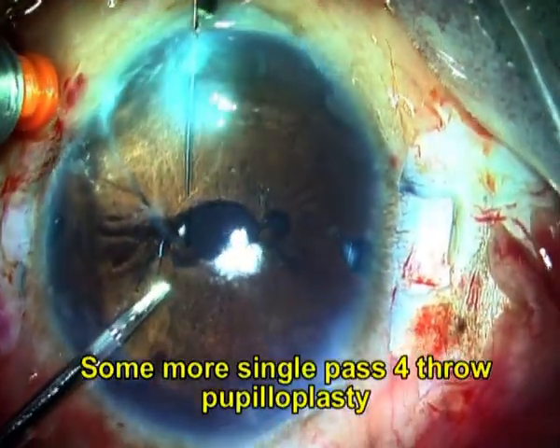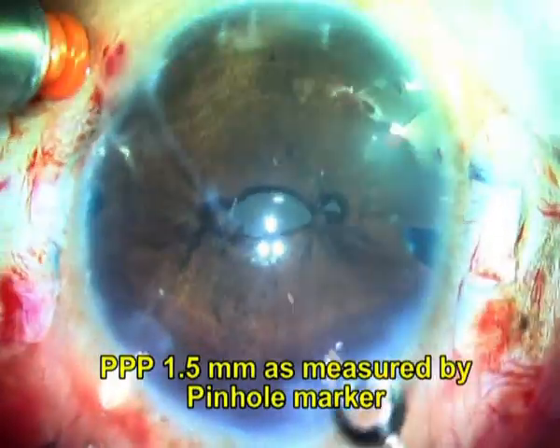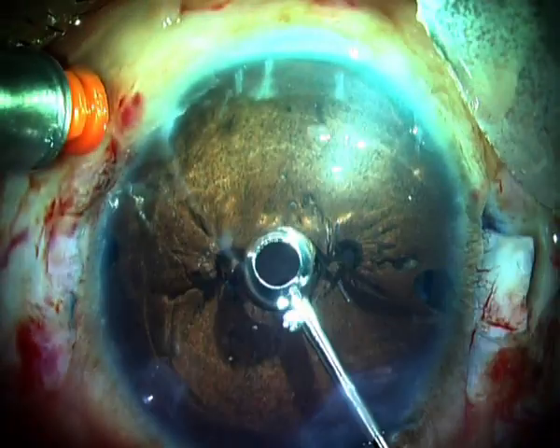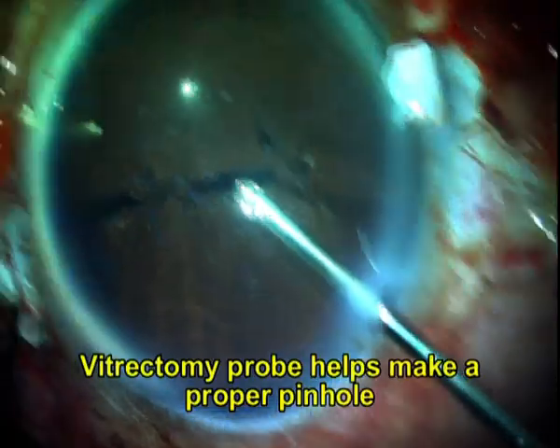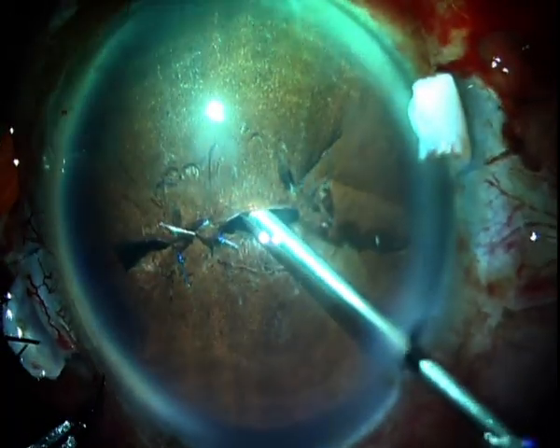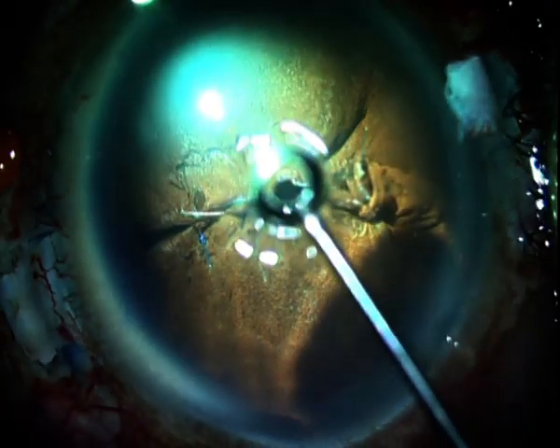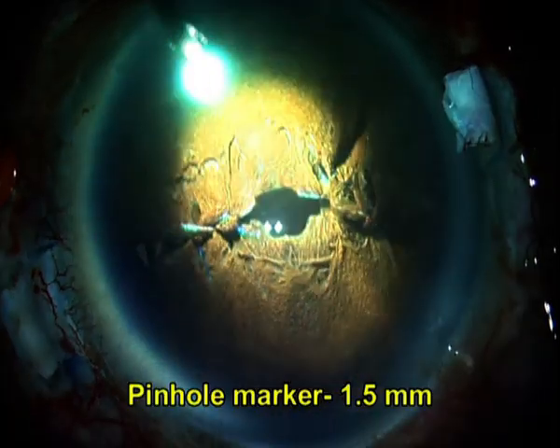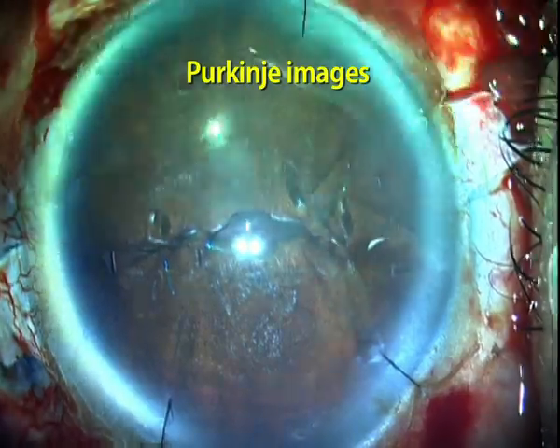Pinhole pupilloplasty, or PPP, helps to filter the stray light from the periphery of the cornea in cases with higher order corneal irregular astigmatism. The pinhole marker can be used at the corneal level, as seen in this case of keratoglobus, where pinhole pupilloplasty was performed. An ideal sized pinhole can also be made with the help of the vitrectomy probe if the pupil has become too small. The light of the microscope can be used to locate the center of the pupil for good centration of the pinhole.